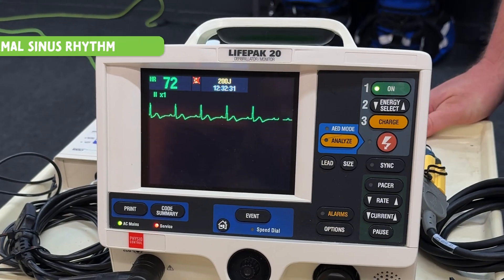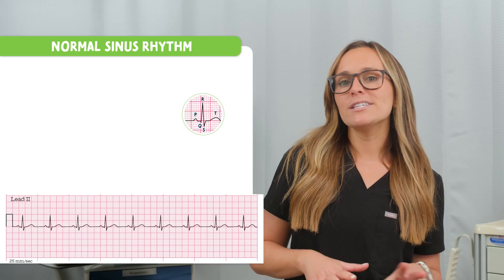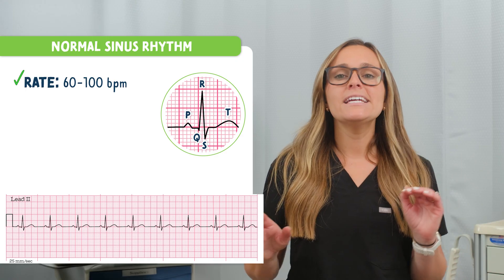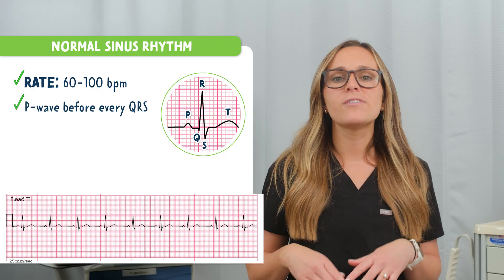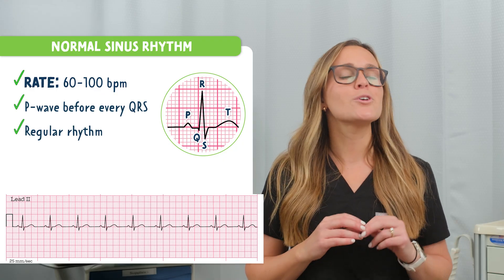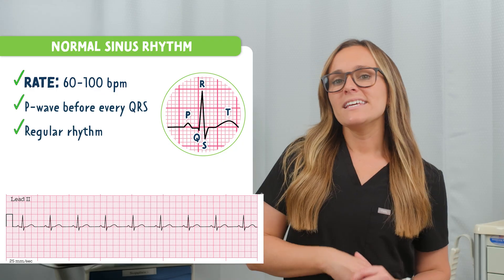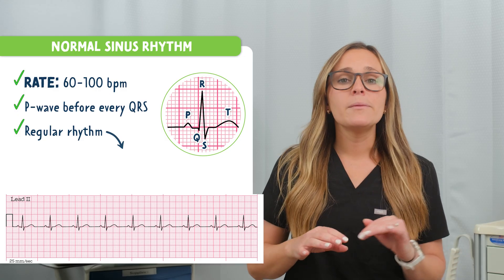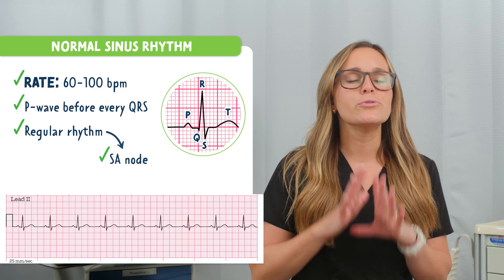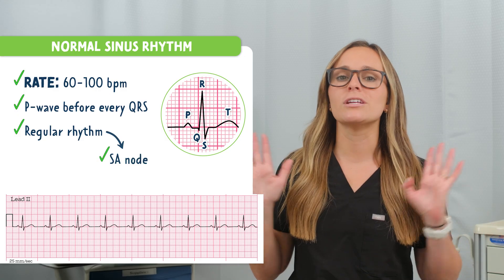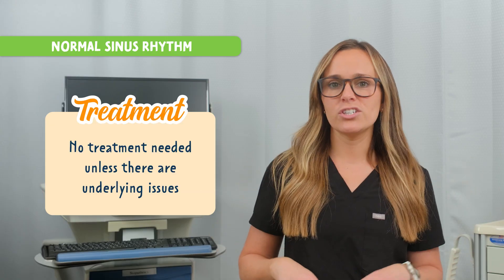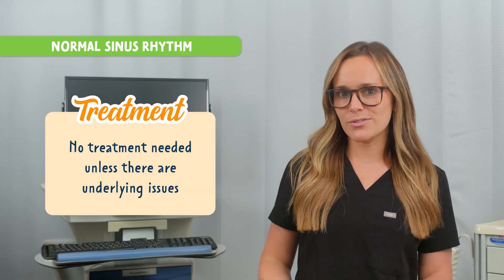This is normal sinus rhythm. The rate is between 60 and 100 beats per minute. Each P wave is followed by a QRS complex, and the rhythm is regular. This means the electrical signal is coming from the SA node and is firing through the heart's normal conduction pathway. No treatment is needed here unless the patient has other underlying issues.